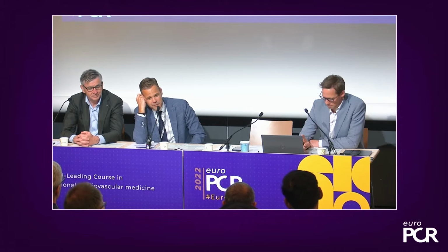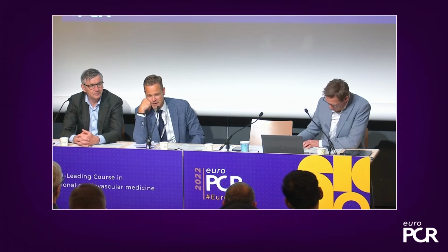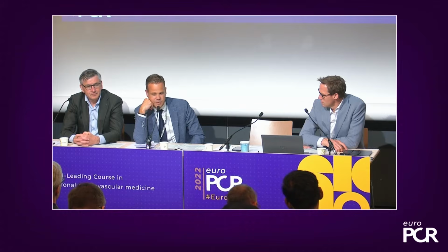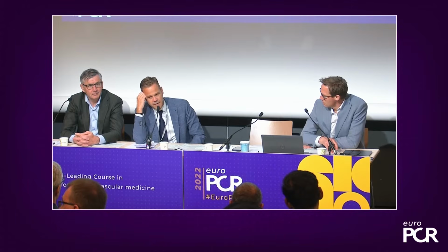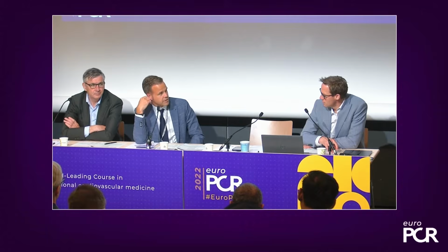Absolutely. For a long time we had the issue in the Netherlands that we do not have reimbursement, so we try to keep it as lean as possible to save some costs, and we only did a TE up front, not in the cath lab, but up front. And why? Because you simply want to know in advance what you're going to look at. What is the morphology? Is there a thrombus?